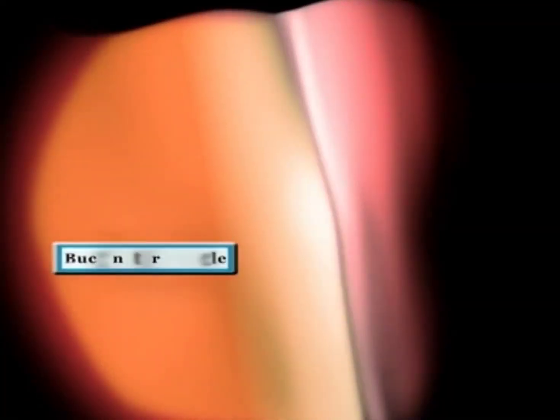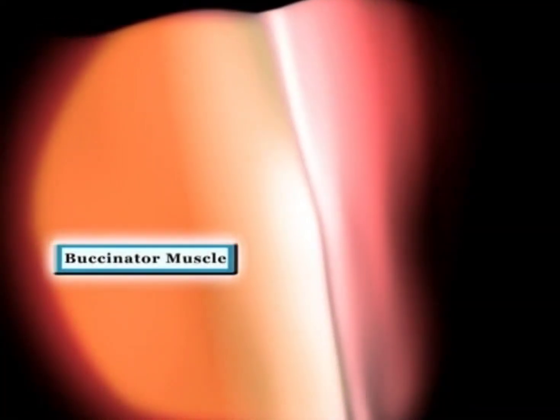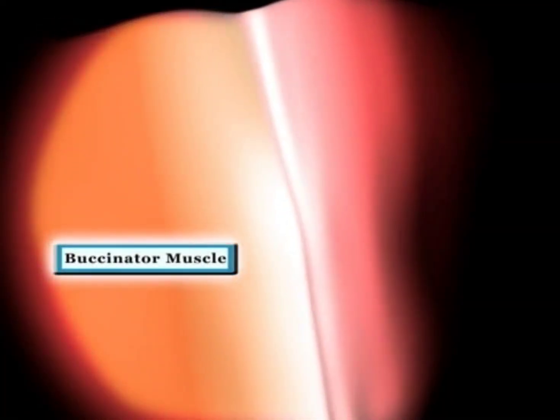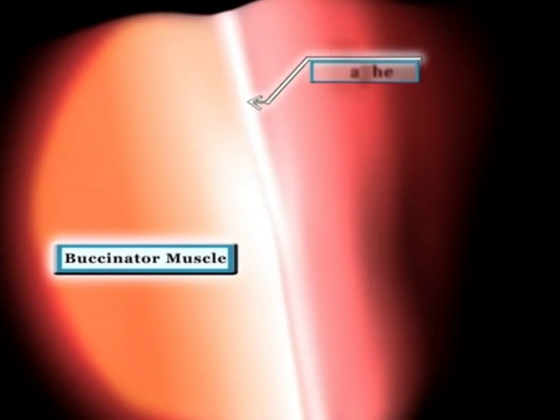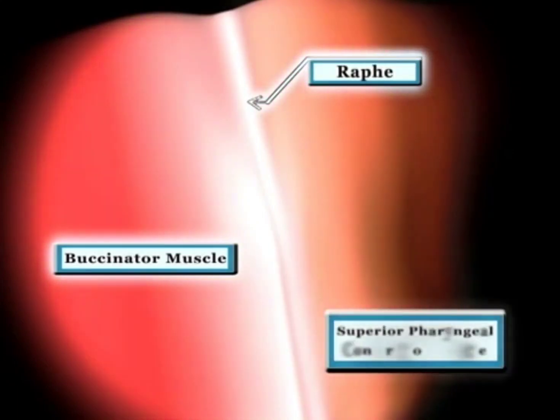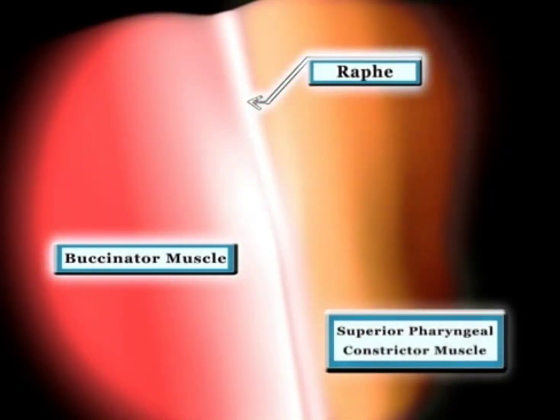Soon after penetrating the mucosa, we're under the buccinator muscle, just lateral to the actual raphae, which connects the buccinator muscle to the more medial superior pharyngeal constrictor muscle.